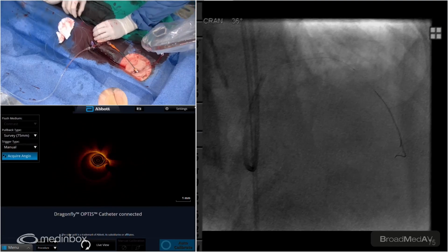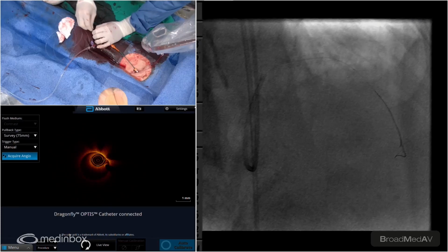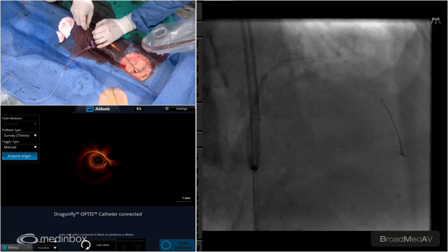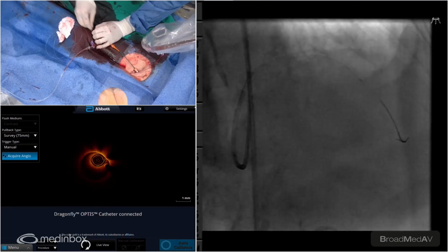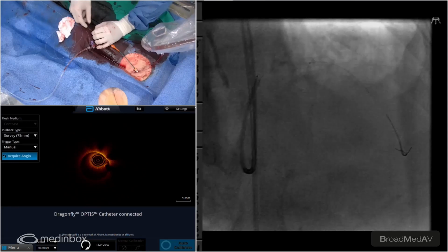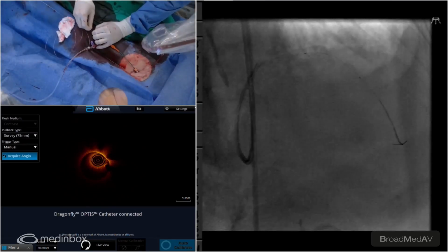We're going to hold on to one of the good co-pilots from now on. I got it. With me a little bit more. Moment of truth. See if it goes through. Oh, wow. I think it's the angulations that's really hurting us. Should we get a guide liner across and then see if we can get this across?